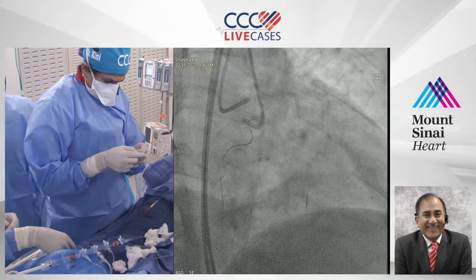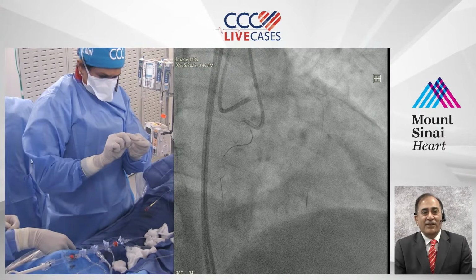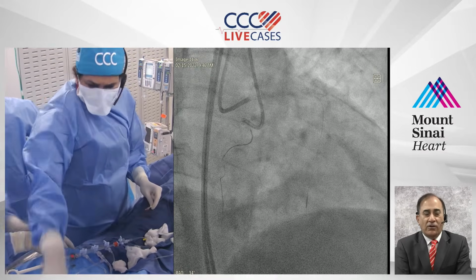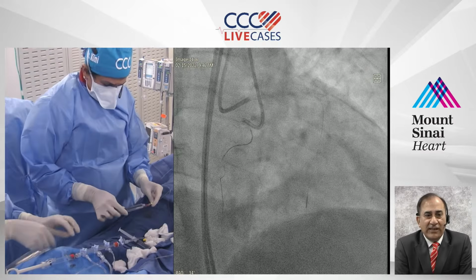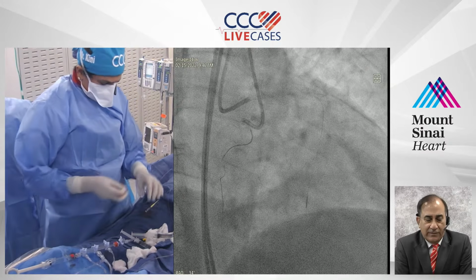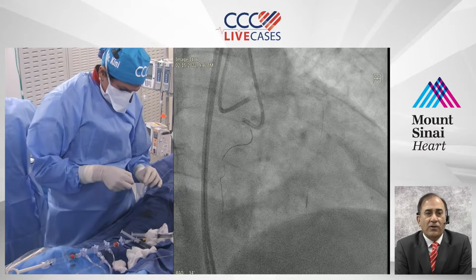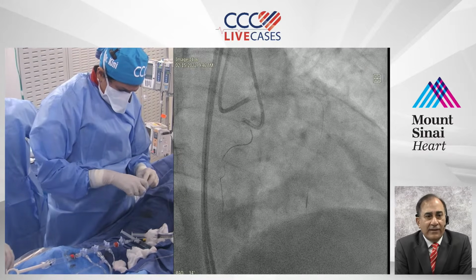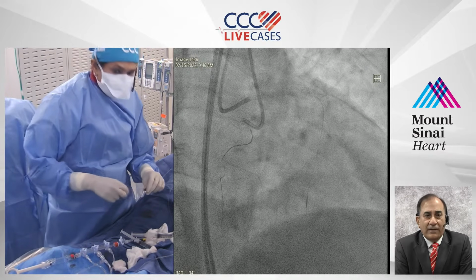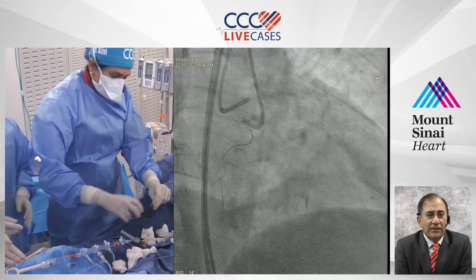All right, and tell us now. Let's go back to the cine. Just about everybody has been complimenting on so many lessons they have learned today, and I think it would also be very deserving to provide a detailed follow-up. How do you plan for this patient? We haven't given up yet. No, she has not given up. Let's see. Okay, where are we now?